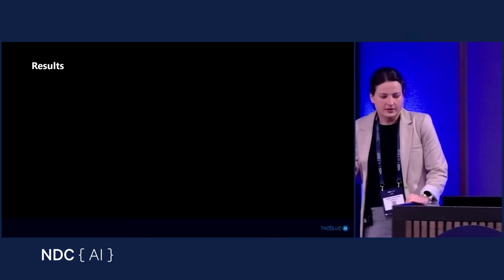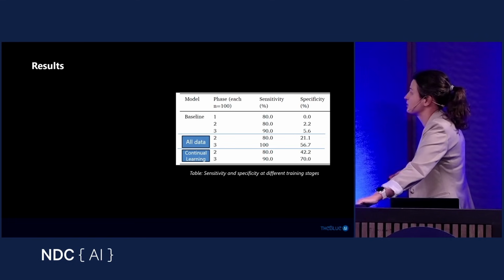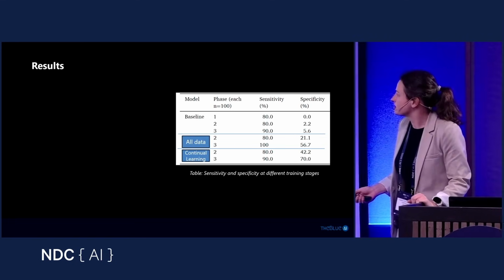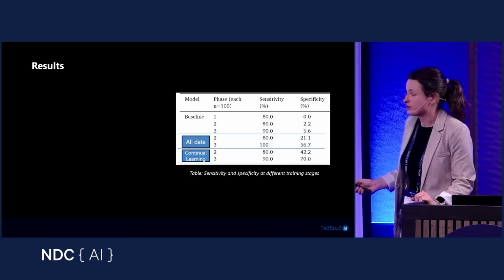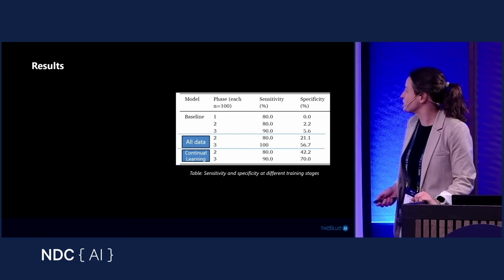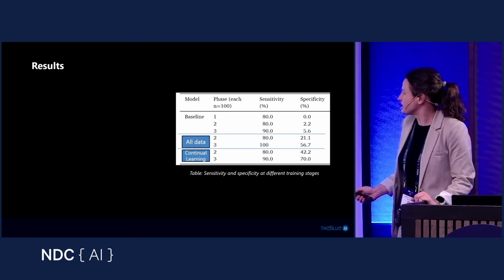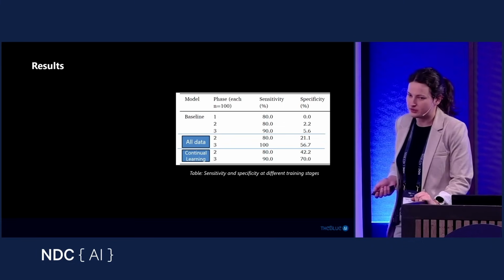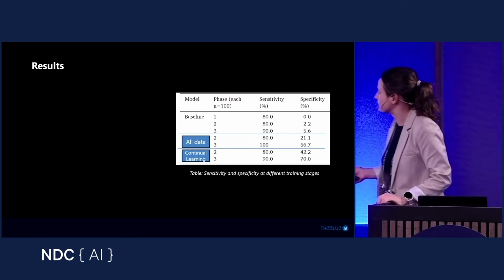So what were the results? The results were actually very promising. The interesting thing that we can see here is that the baseline model behaved as it did before. It was very good at recognizing the FCDs, but it was creating very many false positives the whole time. What happened in the other models? All of the models actually kept similar performance on recognizing the FCDs. But the main difference is in the false positives.